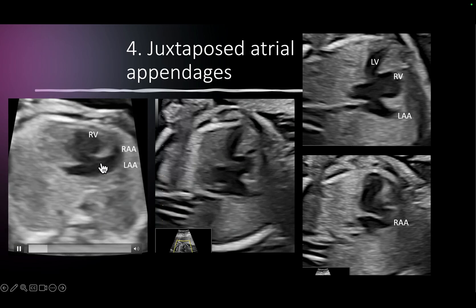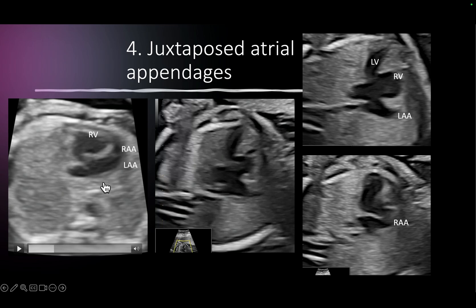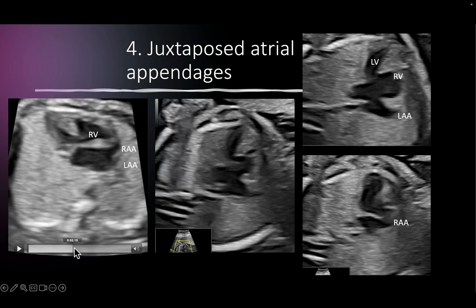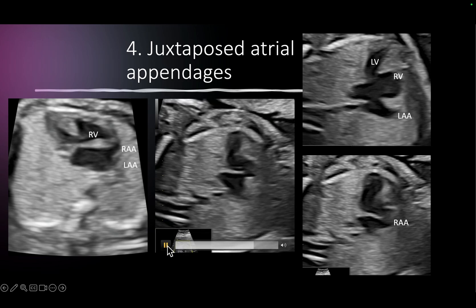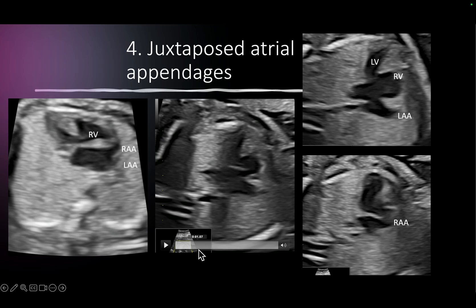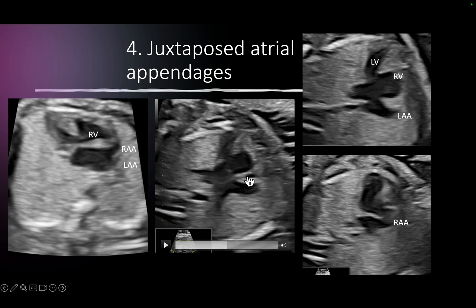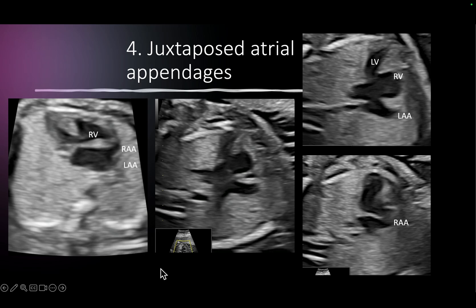Juxtaposed atrial appendages means that both atrial appendages are on one side — either on the right side or on the left side. You notice here: this is the left atrial appendage, which is the large one. As we scroll forward, you see the smaller appendage, which is the right atrial appendage. Both appendages are lying on the right side of the fetus — or both appendages are lying over the left atrium. Remember, the left atrium was on the right side in this case.